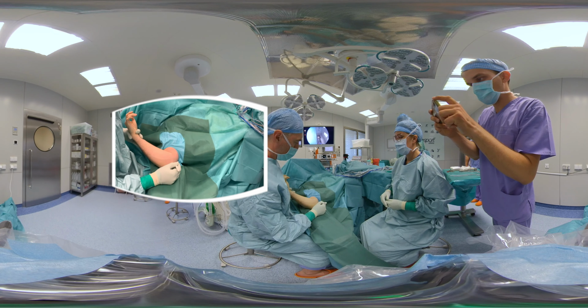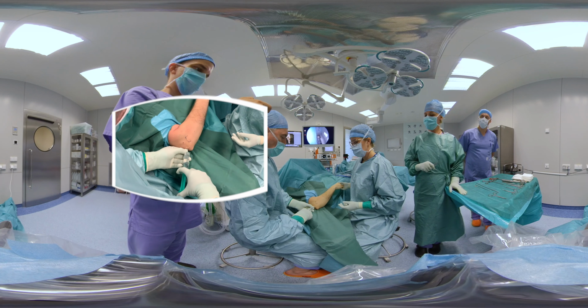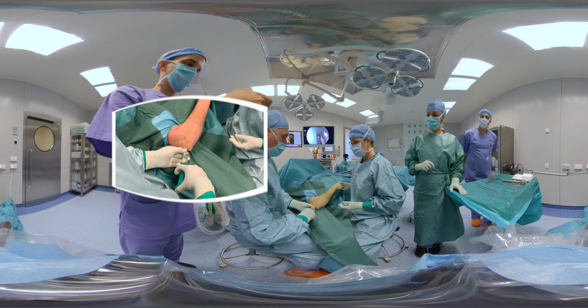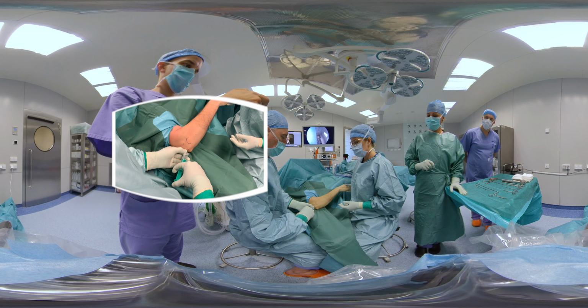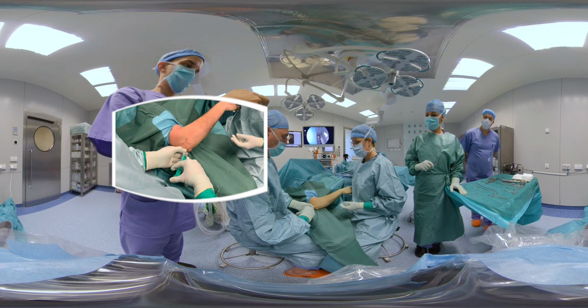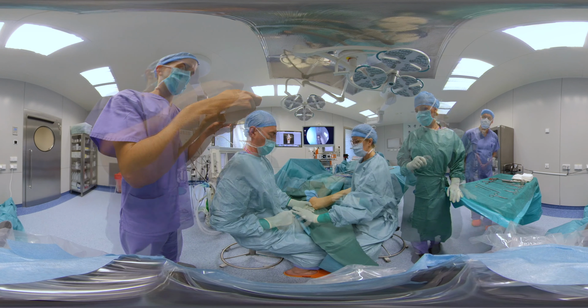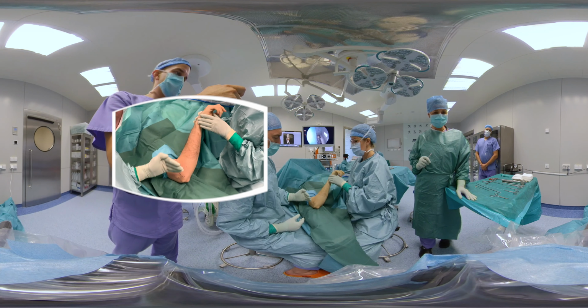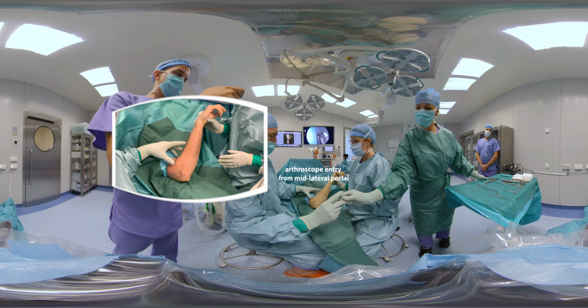Next, needle is injected through the soft spots and capsule expanded with 10 to 20 milliliters of saline. This pushes the radial nerve away from the entry point laterally. After superficial stab incision, scope is inserted via mid-lateral portal.